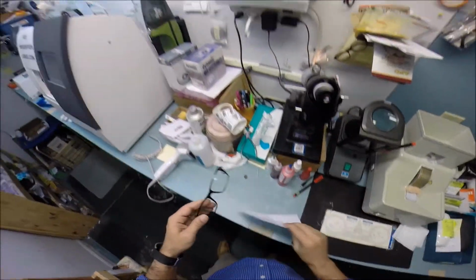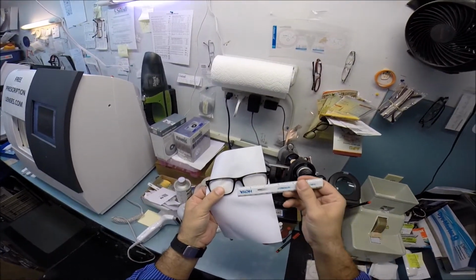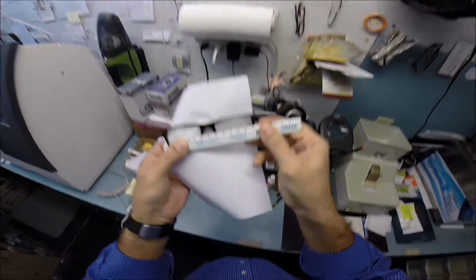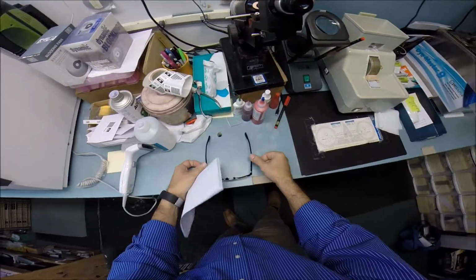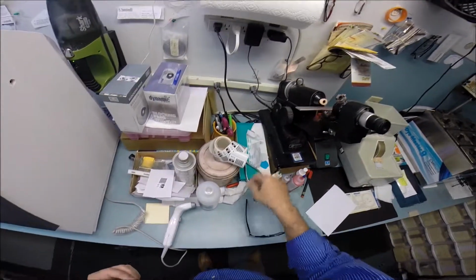Your pupillary distance is 60. This is why I need your prescription, just the white background. I'm going to put my PD stick against my thumb on your right lens, and then we hold it up to the left. We're getting 60 millimeters, so that is cut perfectly. Normally I would adjust glasses, but these are sitting level on the table.